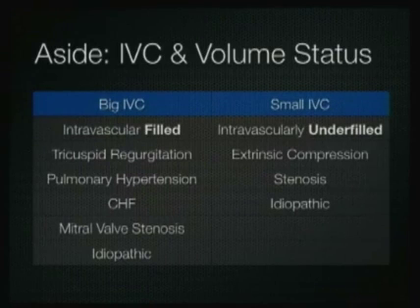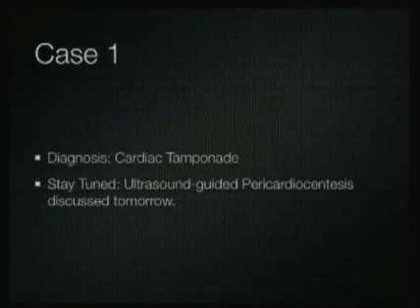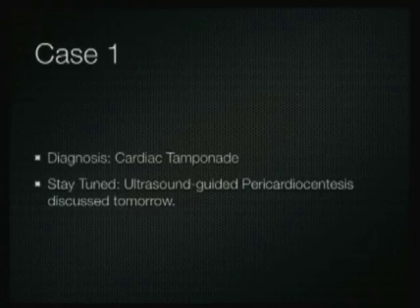And likewise, small IVCs, while they are often caused by dehydration and being intravascularly underfilled, they can also be caused by extrinsic compression, IVC stenosis, or just idiopathically have a small IVC. So case 1 was cardiac tamponade. We are going to discuss ultrasound-guided pericardiocentesis in a different lecture.